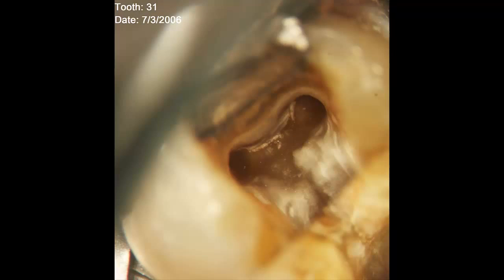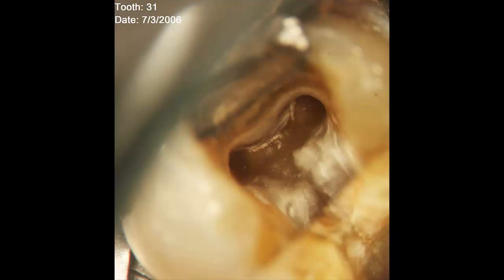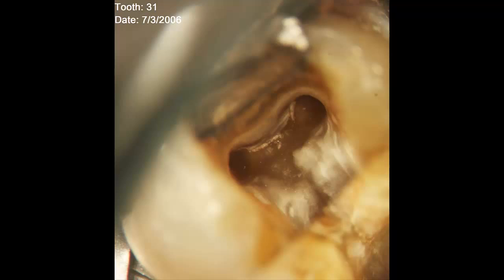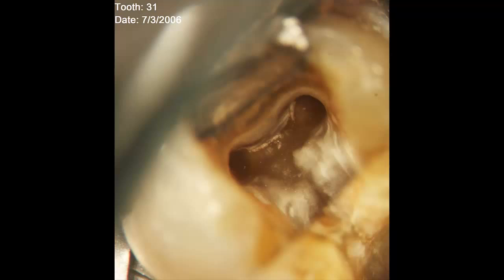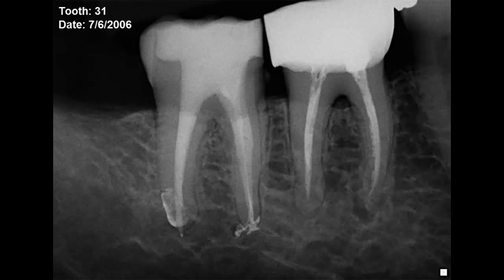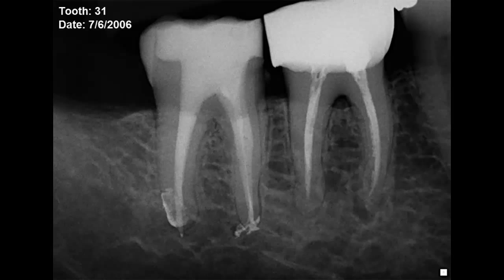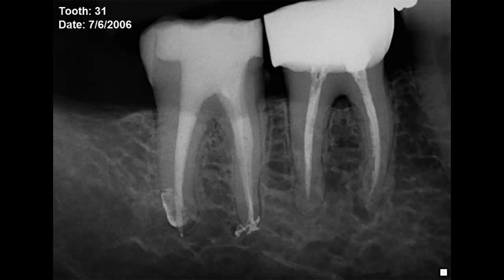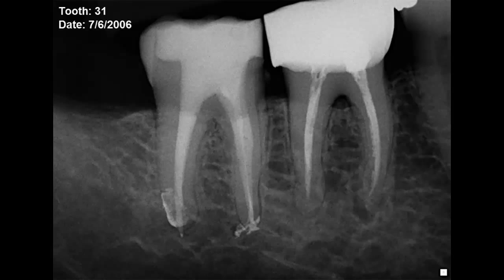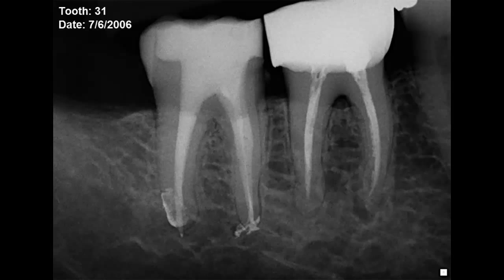All root canal systems were cleaned and shaped with direct line access. Treatment was performed with the classic Schilder technique utilizing hand files, multiple recapitulations to develop the apical prep, and copious amounts of irrigation. When the root canal system was obturated, one can see multiple apical ramifications filled. The tooth was immediately restored with bonded composite resin and then restored by his general dentist with a gold crown.